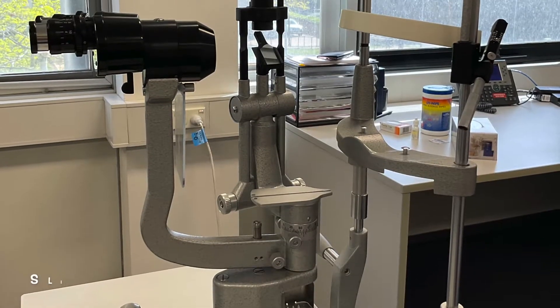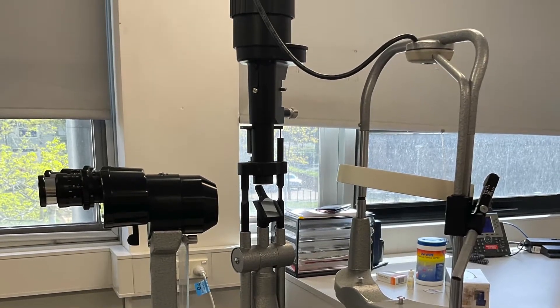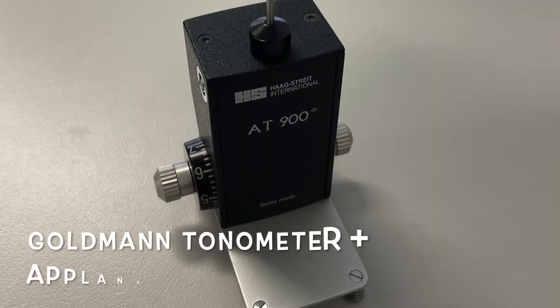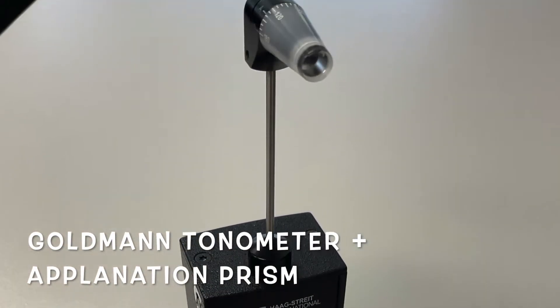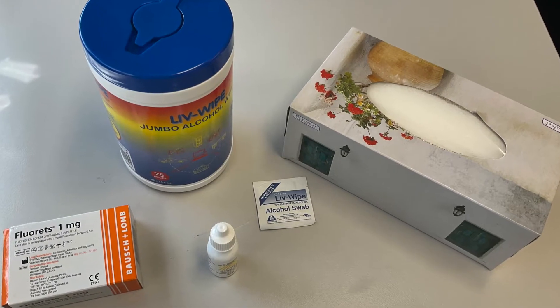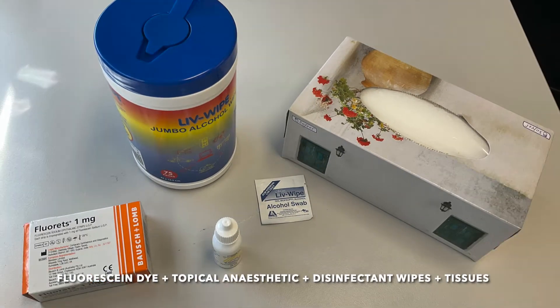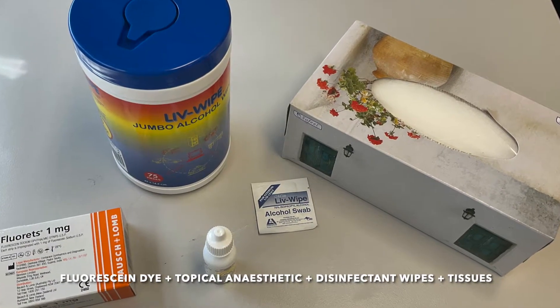To perform this, you will require a slit lamp, Goldman Tonometer, Applanation Prism, Fluorescein Dye, Topical Anesthetics, Disinfectant Wipes, and Tissues.